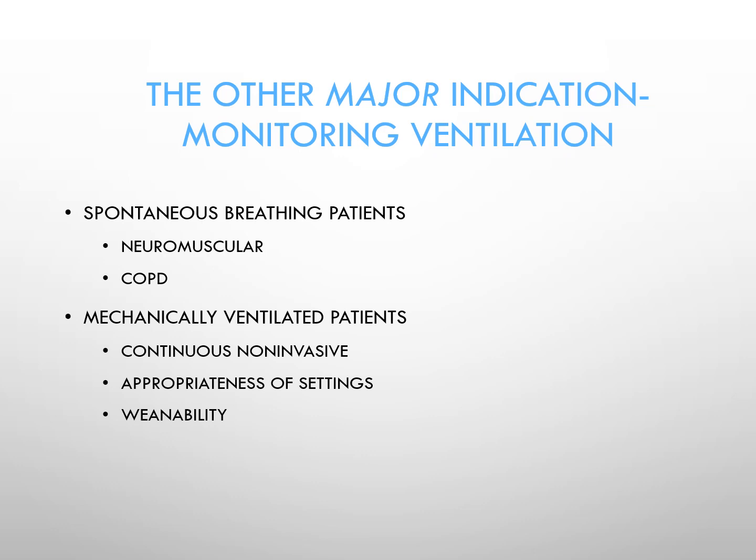With mechanically ventilated patients, looking at continuous non-invasive ventilation, we can actually measure the adequacy of the non-invasive augmentation that we're providing the patients. For both intubated and non-intubated patients, it can speak to the appropriateness of the settings. If it's non-invasive, is the difference between the IPAP and the EPAP, the delta P, sufficient? If there's a backup rate, is the rate sufficient to keep the end-tidal CO2 within targeted levels?